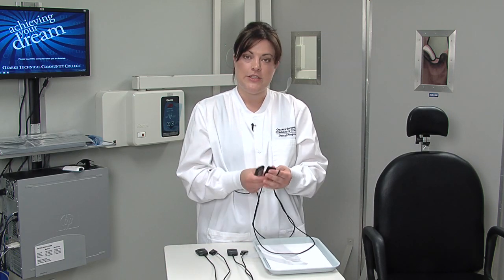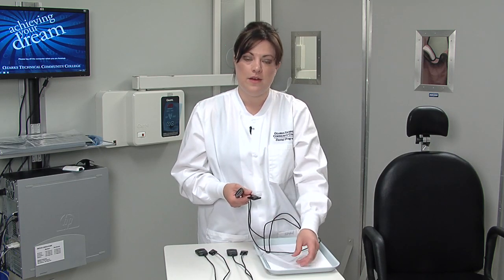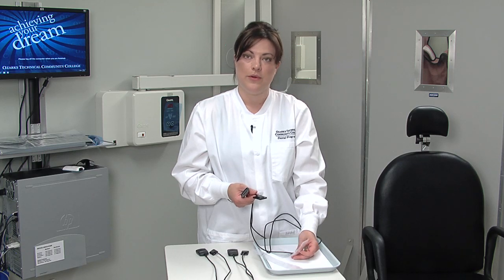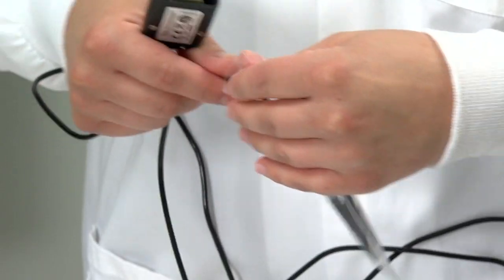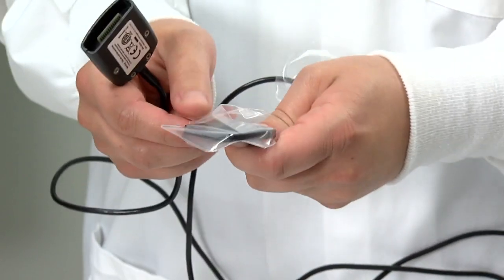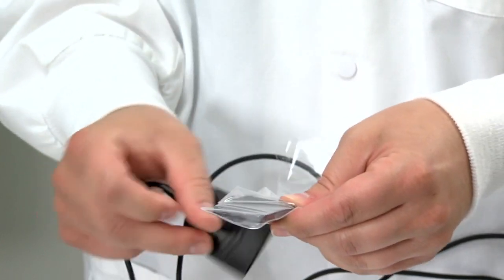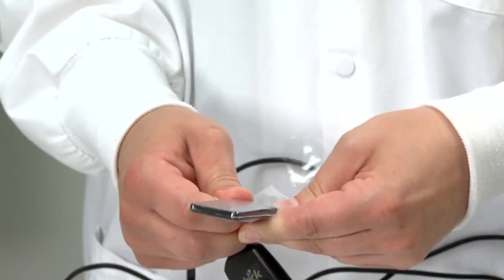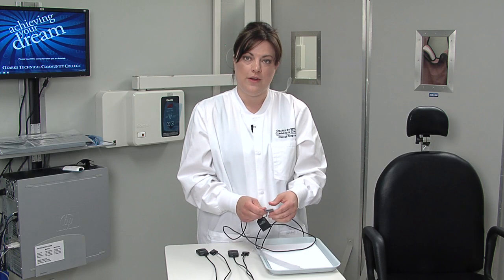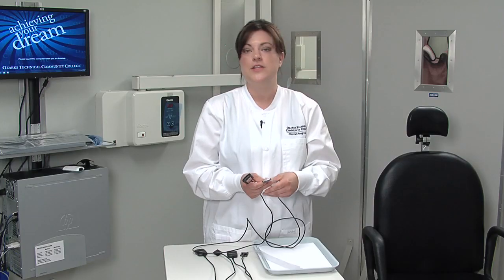When you're ready to actually use the sensor, you'll retrieve one from the sensor cabinet, and there are barriers. We have size 1 and size 2 appropriate to each size of sensor, and they're basically just a plastic sheath that you're going to run the sensor into. And the tip of this is pretty tight, so once you get to a certain point, you'll really have to push to get the sensor all the way into the barrier, and this will help later to ensure that there's not any movement once it's in the patient's mouth. Once you have the digital sensor barrier, you're now ready to use this on a patient.